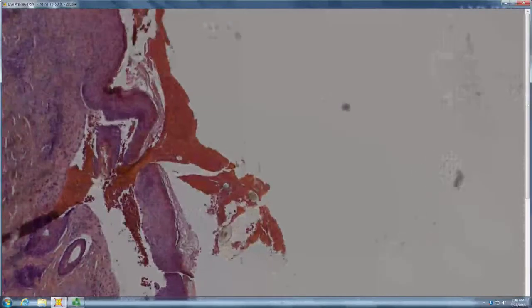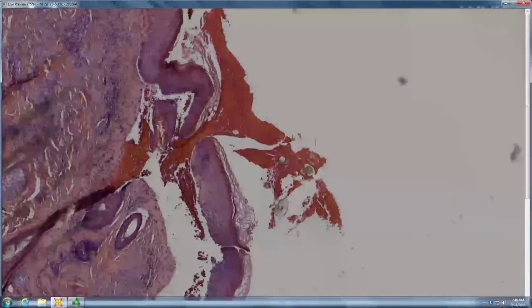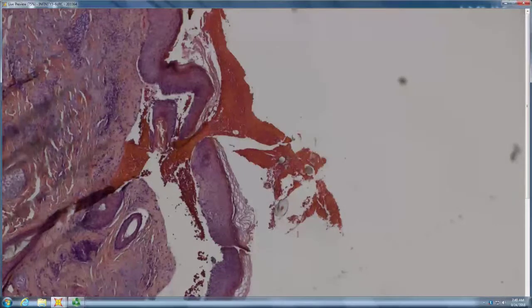Split. I think it's subepidermal. Yep. Probably like a BP, EBA type picture. And in this case, it was disease limited to scalp with a lot of scarring, no mucosal involvement at all.